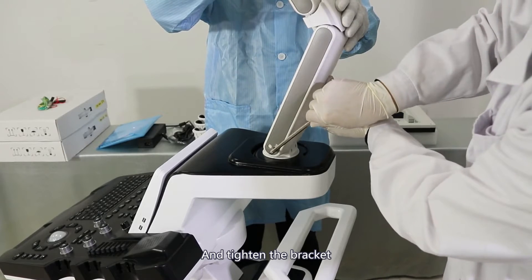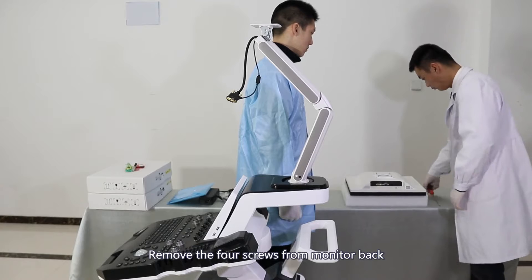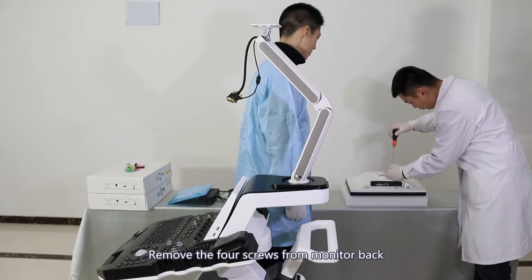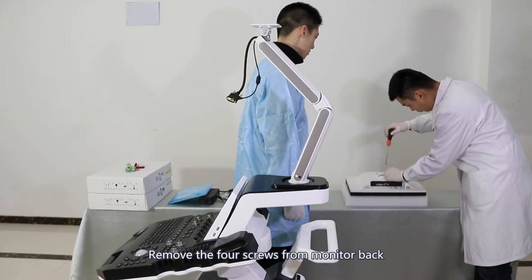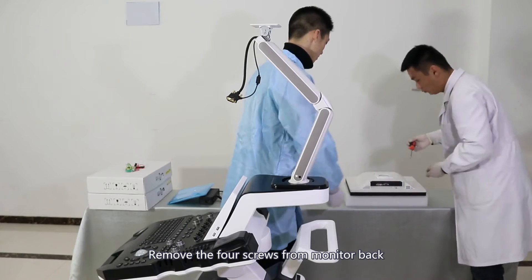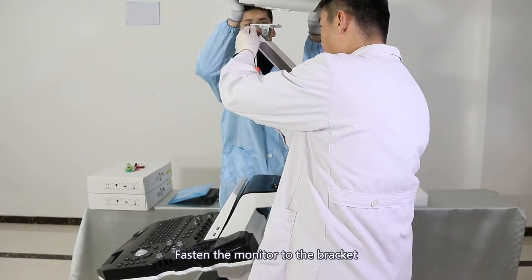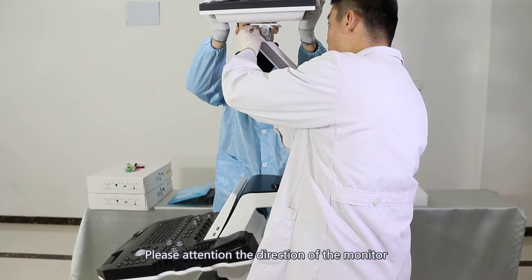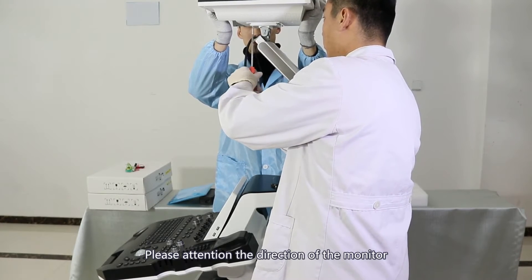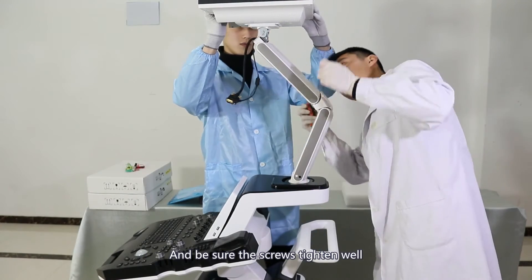Remove the four screws from the monitor back. Fasten the monitor to the bracket, paying attention to the direction of the monitor, and be sure to tighten the screws securely.